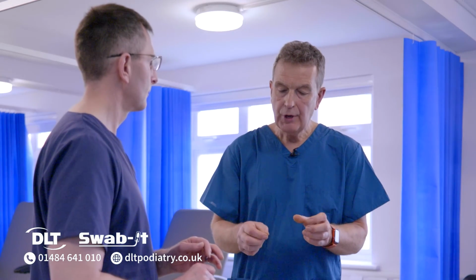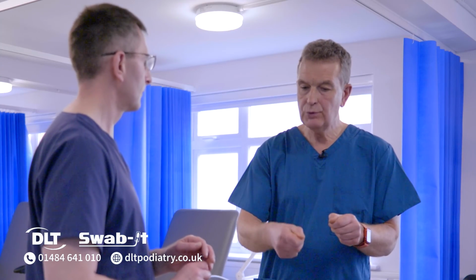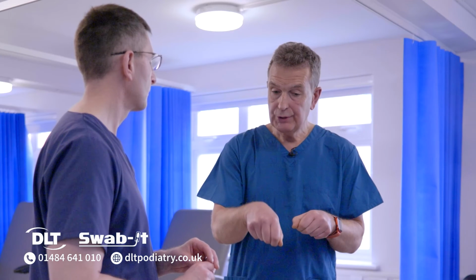And that is, if you think about it, you've got an applicator with a bud, and that bud's an absorbent bud. So if you do not apply pressure when you apply it, a lot of the phenol will stay within the bud and you're at risk of getting regrowths. So it's really important when you apply it to the nail matrix that you roll it backwards and forwards with pressure so it releases the phenol, and then you can move the phenol across the whole of the matrix in the case of a total avulsion, or just within the corner if it's a single wedge resection.